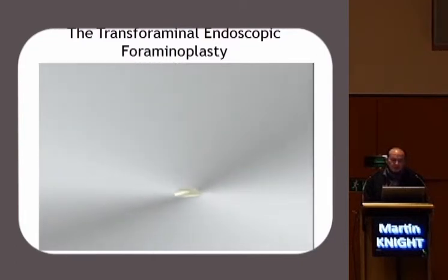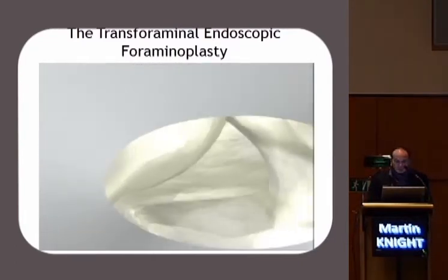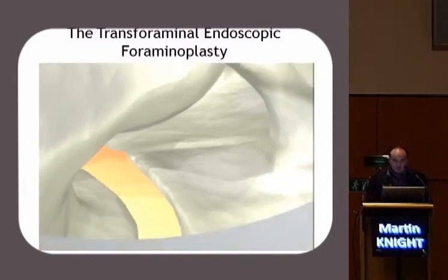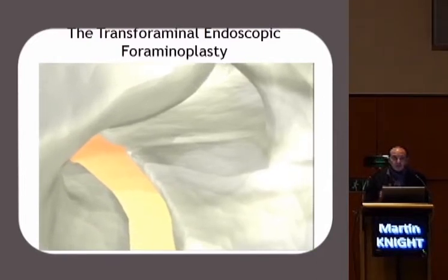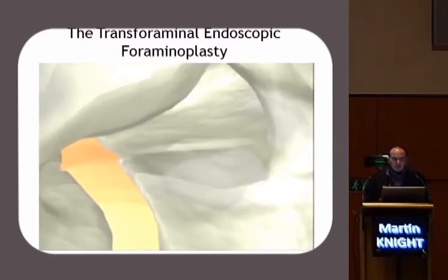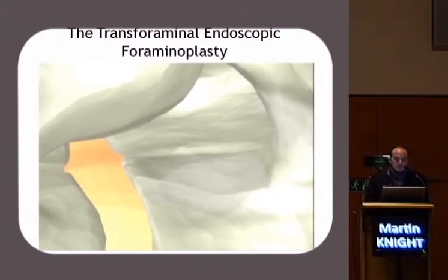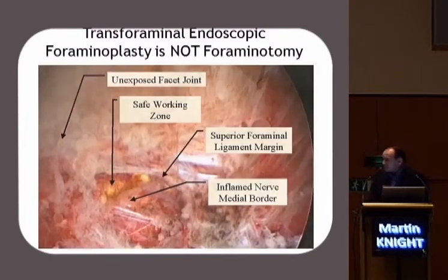As you've seen, we pass down through the foramen, and you'd expect to see a nice clear working zone when you get there. Of course, if you're just going for endoscopic discectomy, you won't really see this area — you'll be going straight into the disc. But in fact, most times you're faced with this: you can see the nerve, just see the border of it there, and it's deeply tethered. We're looking from the right-hand side, and there is the facet margin hiding there, and that is the tethering which is causing an awful lot of the patient's symptoms.